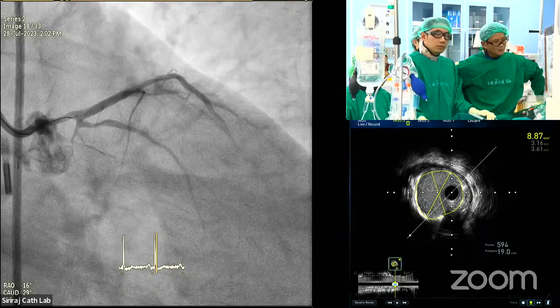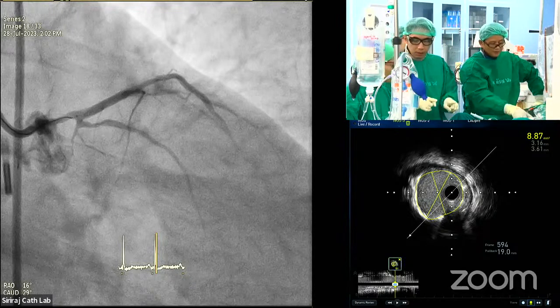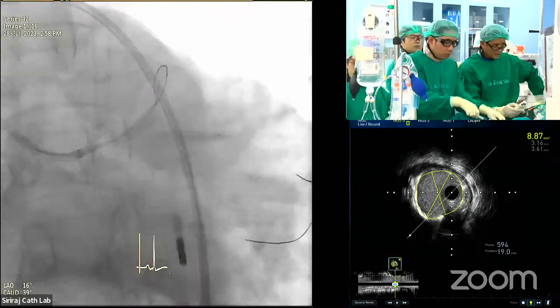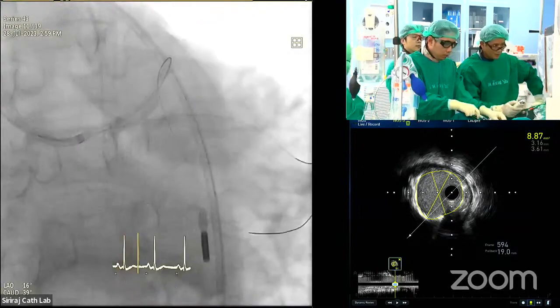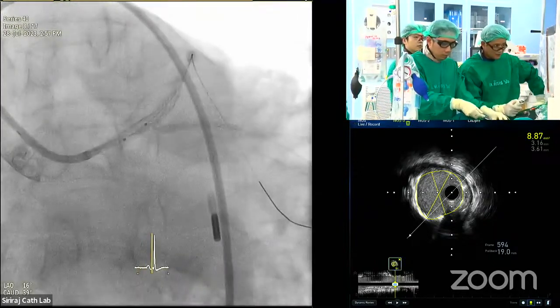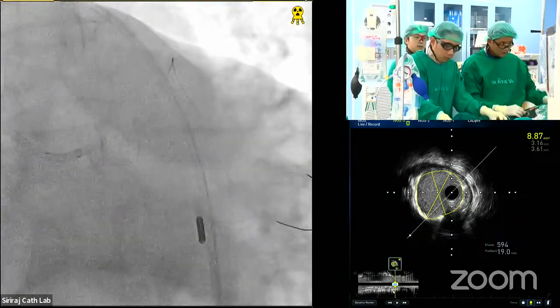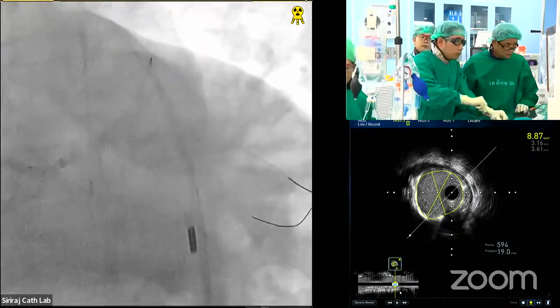I think it's 1,1,0. We're thinking that we just leave the ostium, stenting in the small circumflex, not occluding the circumflex, and just stenting at the OM. I think that might give a better long term outcome. But now the ostium could be compromised, right? Yes. How are you going to assess it then? Goran, do you have any ideas about this?